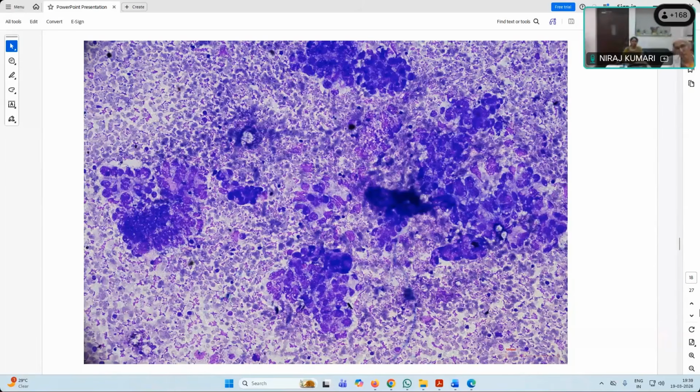He is a 3-year-old boy and has the lesion for the last 1.5 years. Would you like to know something from the clinician? You just now got a history that this child has an undescended testis. Now, would you like to ask something else to the clinician in this morphology? Markers, AFP. Yes. Yolk sac tumor we can suspect. So you will ask for alpha-fetoprotein levels. Okay. Any other marker?